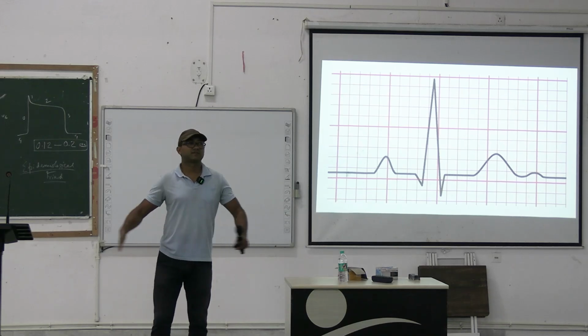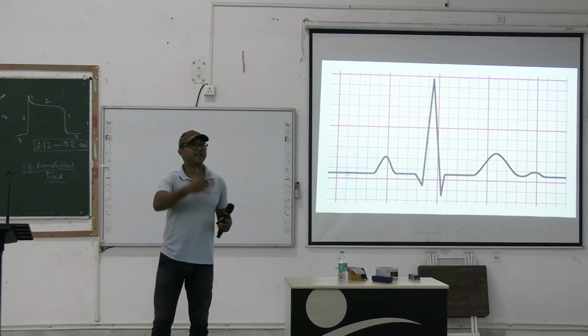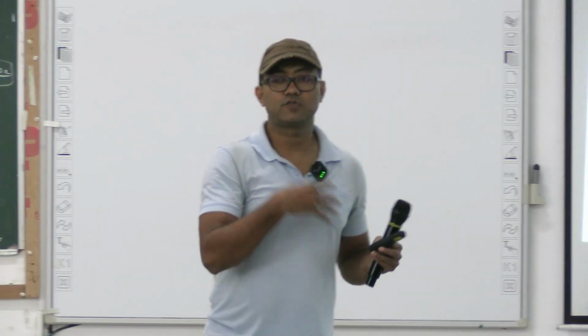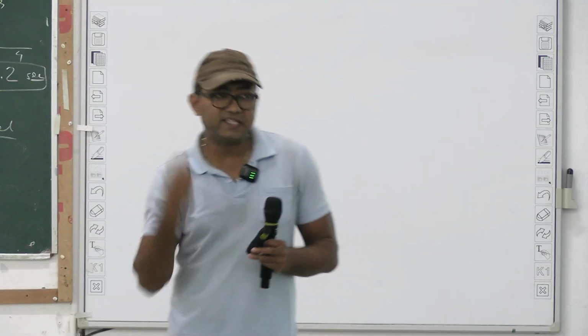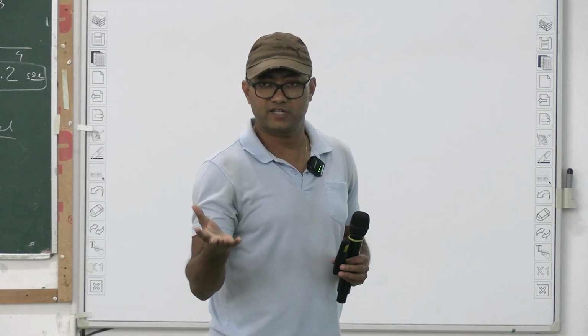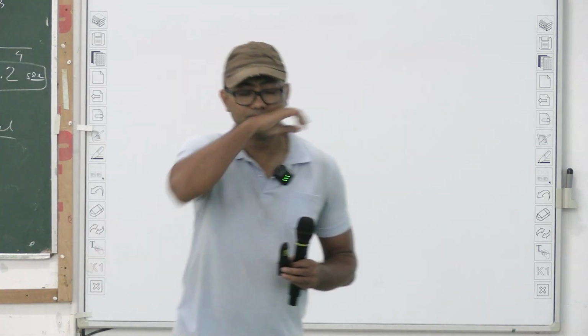And physiologically, when will QRS voltage decrease? When the patient is obese. So skin, different layers of skin, then subcutaneous fat, then at the depth there is heart, right? So voltage will be less. And when the patient is very thin built, very skinny, then QRS voltage will be high. So this is normal, there is no problem with it. Someone may be thin built or someone may be obese, right?